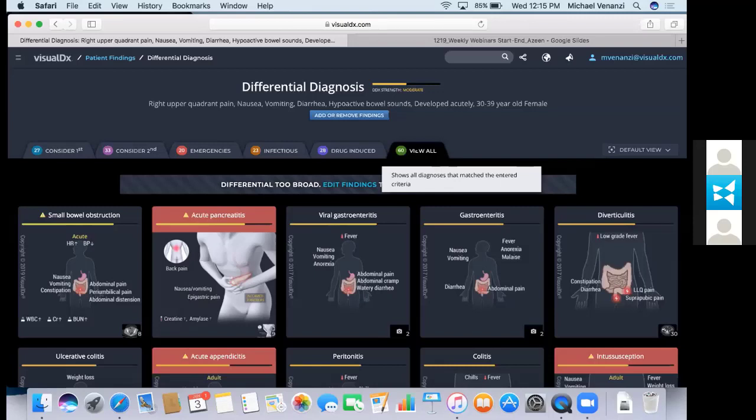One of the ways I first came in use of this was during residency. And during residency, obviously, you can clearly see how this is helpful. You have a consult in the middle of the night. You need to have a broad differential, and you need to be able to narrow your differential before you even sign out to your attending. And you need to be able to compare all your differentials and argue why you think it's diagnosis A versus diagnosis B, and make your case that way. That's in residency.